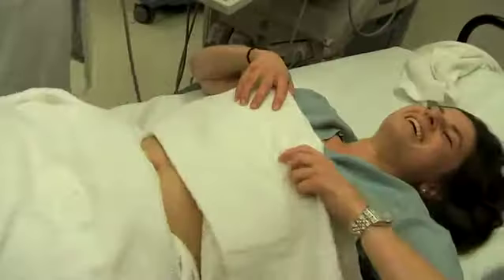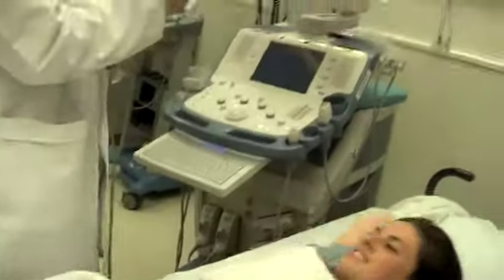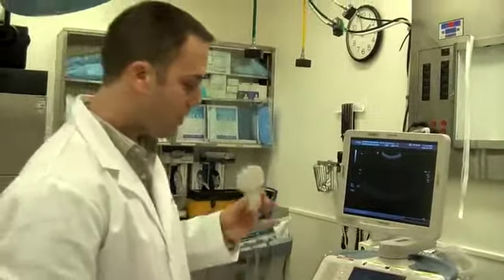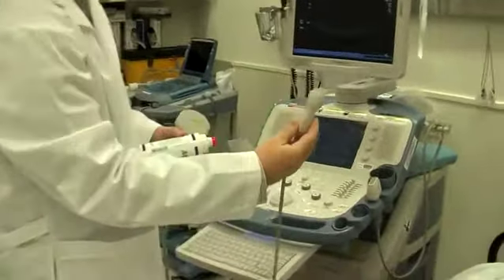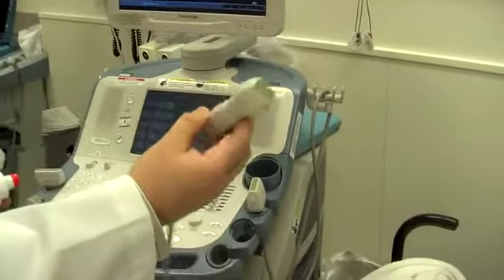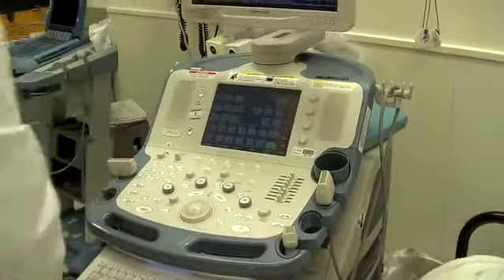Okay. All right. So for the gallbladder scan, you can use the C60 probe because it's a low-frequency probe, a good abdominal probe. You can also use the phased array, small footprint, because sometimes the gallbladder is best visualized in between the ribs, a little bit higher. So it's got a small footprint, so it's easy to get between the ribs, and it's also low frequency. You can also use the microconvex probe because it's low frequency and it can get between the ribs, the curved array here.